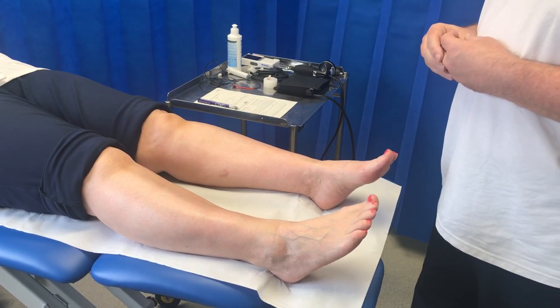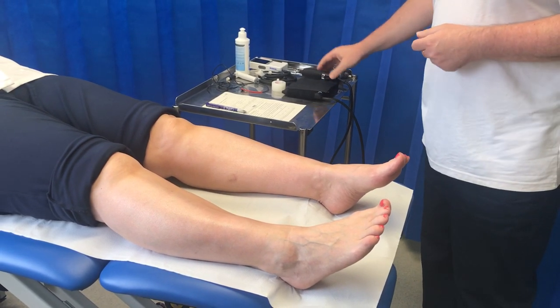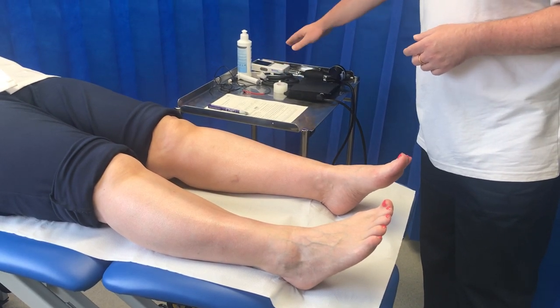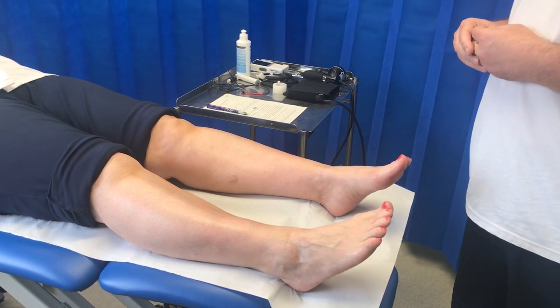My patient has presented today, so I'll start by getting my kit available: my sphyg cuff, my PPG tubes, my PPG sensor, my Doppler, my gel, my tape, and my brief critical limb ischemia assessment profile, which will remind me what to do.